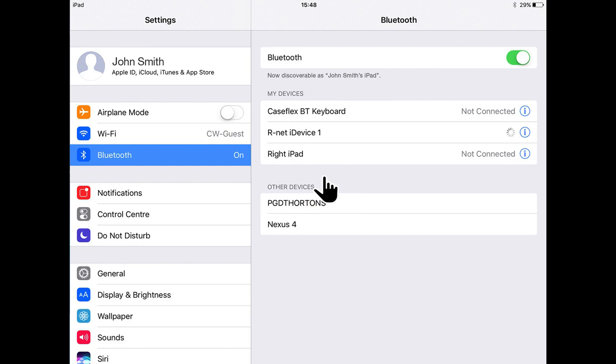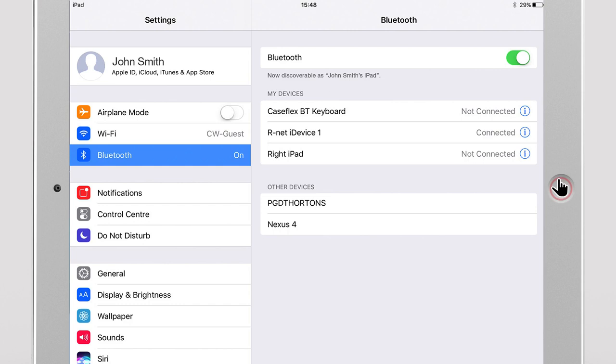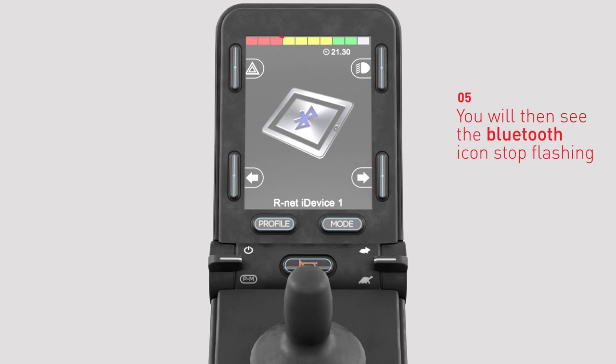The Apple iOS device will start the Bluetooth pairing process. After a short period of time, you should see R-Net iDevice 1 is in the My Devices list and connected. The Bluetooth icon on the joystick LCD screen will now stop flashing, indicating the pairing has been successful.